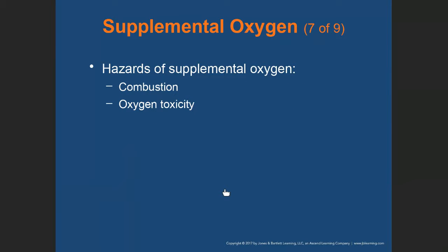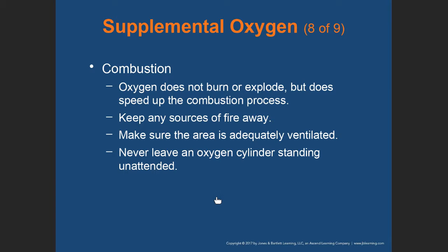Now, hazards of supplemental oxygen. Combustion: oxygen supports the process of combustion, and you have to be mindful of oxygen toxicity. So we cannot give the patient too much oxygen. It can cause complications. Combustion: oxygen does not burn or explode, but it does speed up the combustion process. Keep any sources of fire away. Make sure the area is adequately ventilated. Never leave an oxygen cylinder unattended.